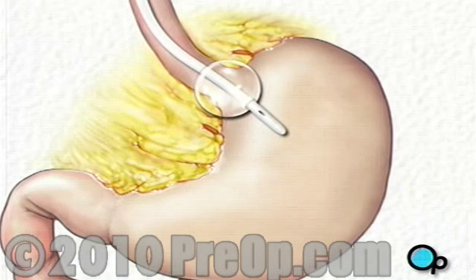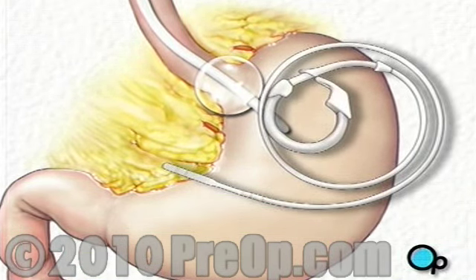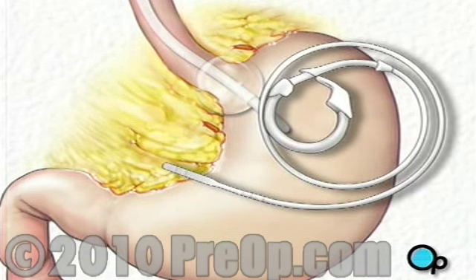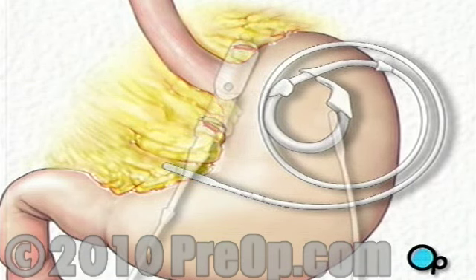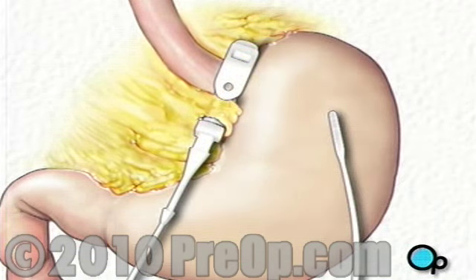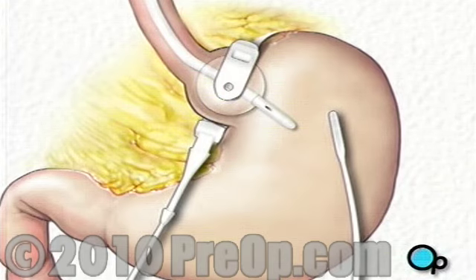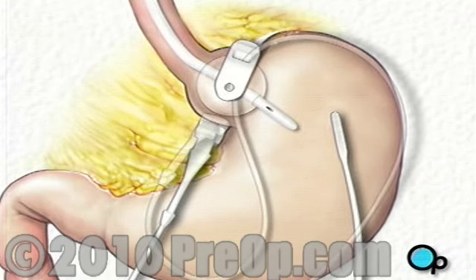Next, the team will insert an adjustable band into the abdomen. After deflating the balloon, your doctor will guide the band until it circles the top of the stomach. Once the band is in place, the team will check the position by reinflating the balloon. After making any final adjustments to the position of the band, your doctor will tighten and lock it into place.